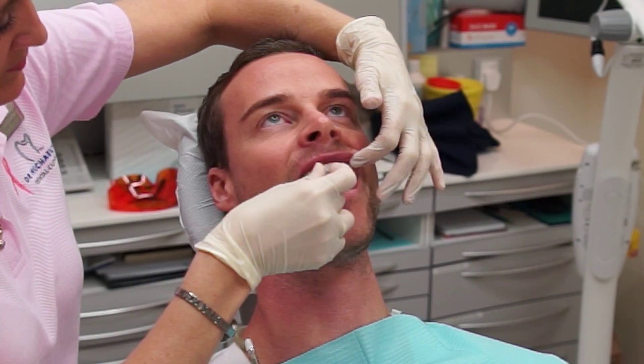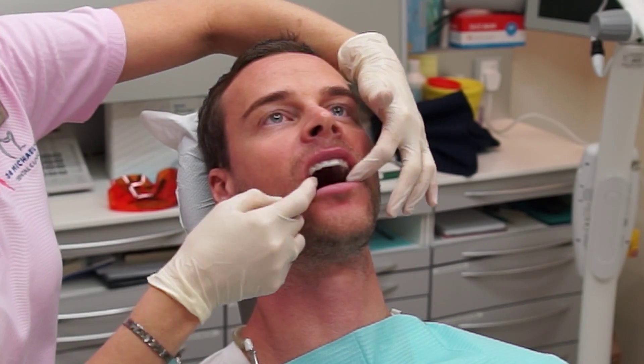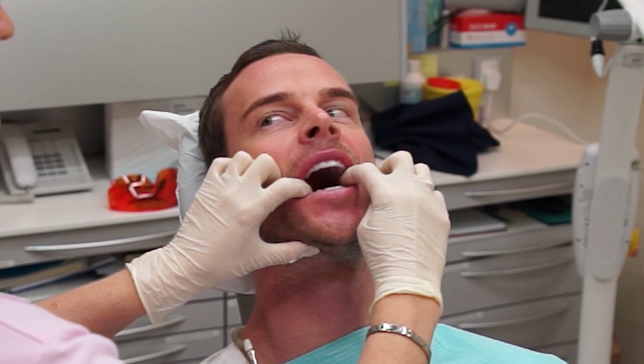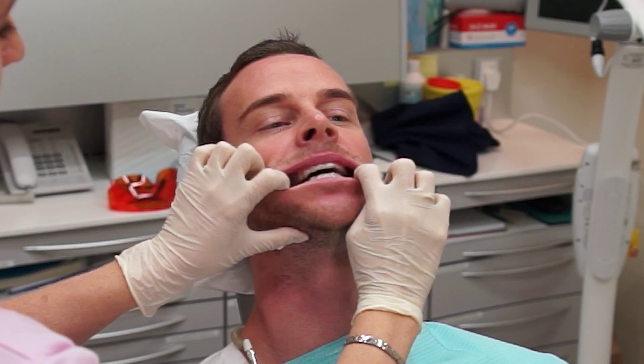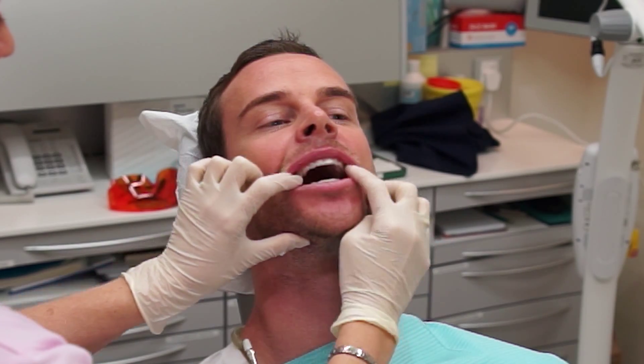These transparent trays are very comfortable and once you place them in position, the gel spreads out on the entire buccal surface of the teeth. Both upper and lower gel trays are worn during the night to do the top-up whitening at home. And you can see very happy patients with a nice change to the color of their teeth.